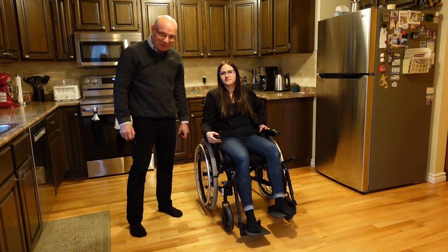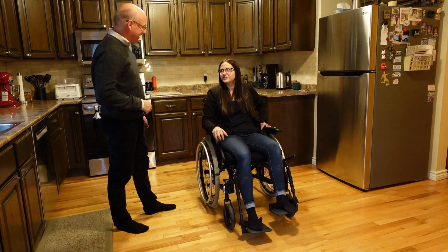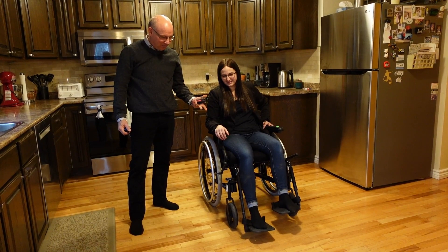Hi, we're the Mobility Ability Duo. I'm Dils. And I'm Cass. And today we're talking about adjusting footrests.